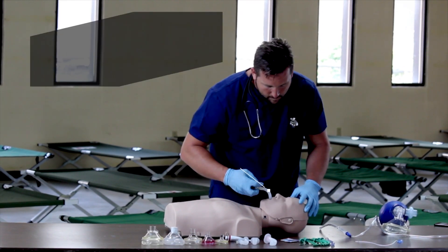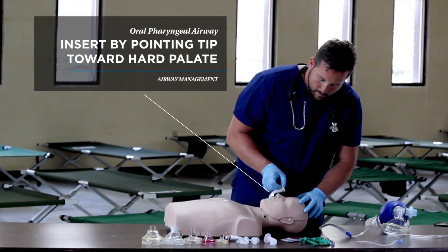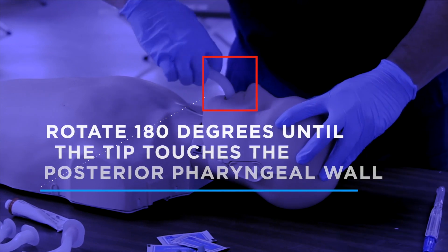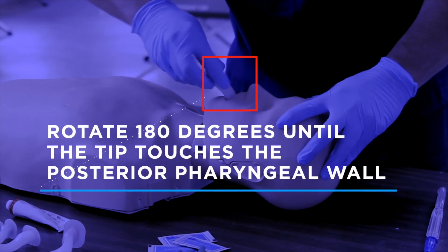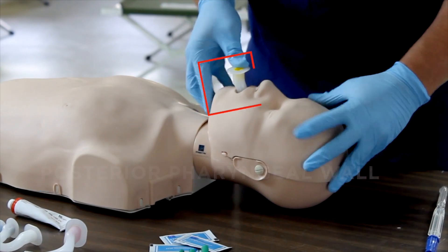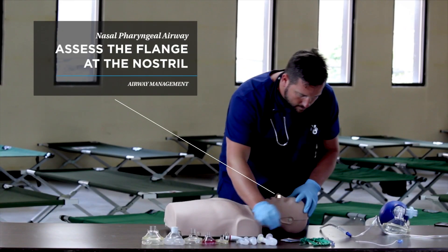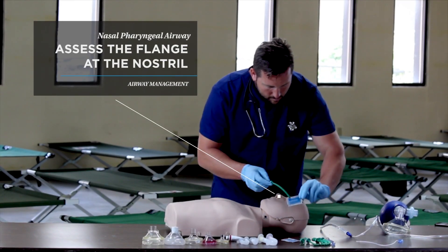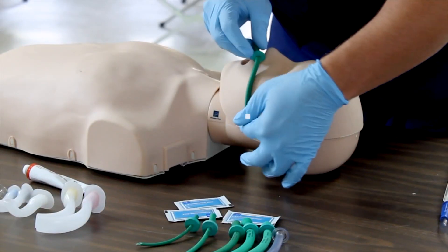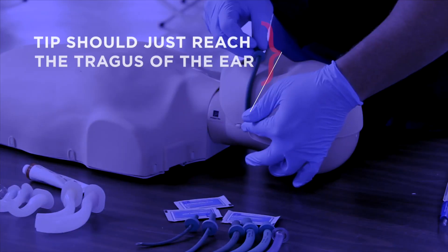Insertion of the oral pharyngeal airway is achieved by pointing the tip toward the hard palate and then rotating 180 degrees until the tip touches the posterior pharyngeal wall. Selection of the proper size nasal pharyngeal airway is done by assessing the flange at the nostril, and the tip should just reach the tragus of the ear.